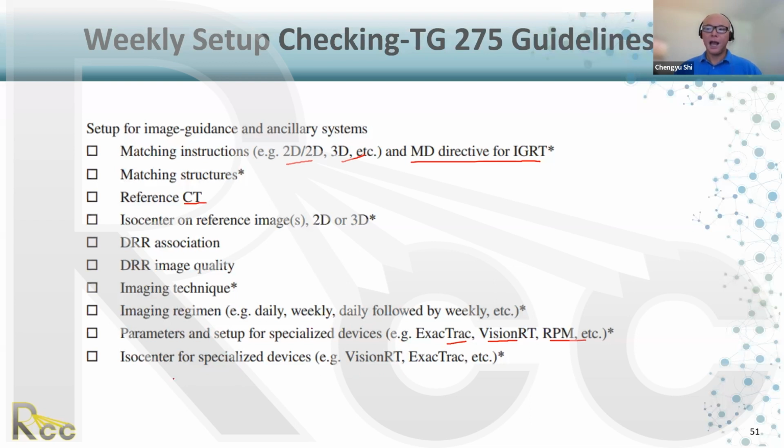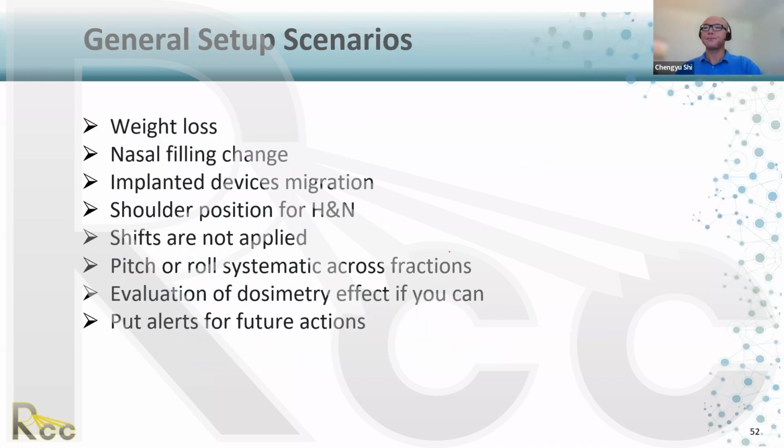Are they still the same? And the ISO center is the same. The reason is at a machine you are kind of time limited. You may have 3 to 5 minutes for the checking, and now you have more time. You can look in more detail and double check your co-workers' work.